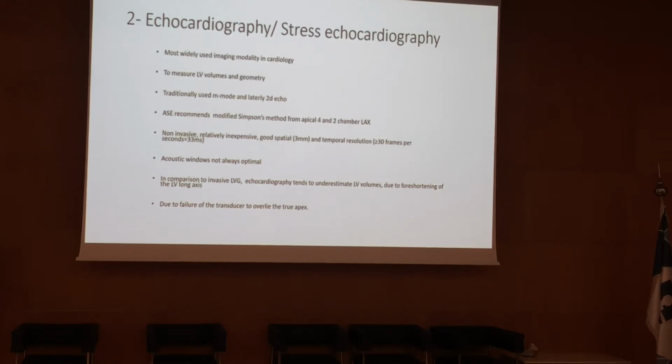Okay, so what's the benefit of echo in cardiology? What do we do, or why do we do echo? There are a couple of things to assess. Go ahead. Check for the valves. Okay, excellent. Go ahead. Assess the function. Function.